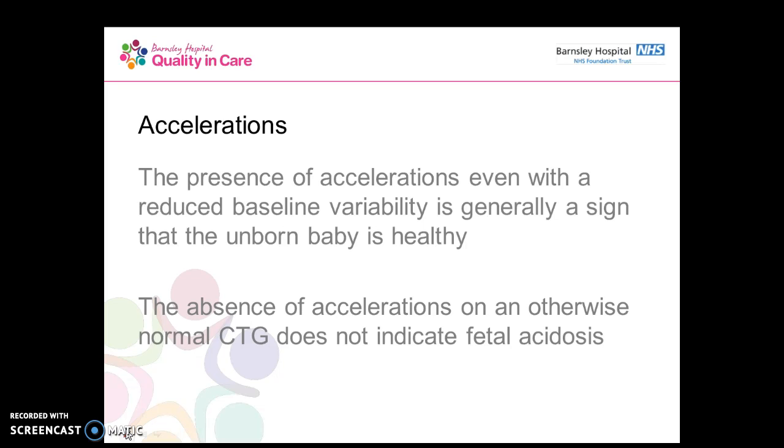So what NICE is saying is that the presence of accelerations, even if you've got a bit of reduced baseline variability, is a sign that the baby is able to respond to changes within its environment and to hypoxic changes, and so it's doing okay. If you've not got any accelerations on a tracing but every other part of it is okay, it doesn't necessarily mean that baby's becoming acidotic.